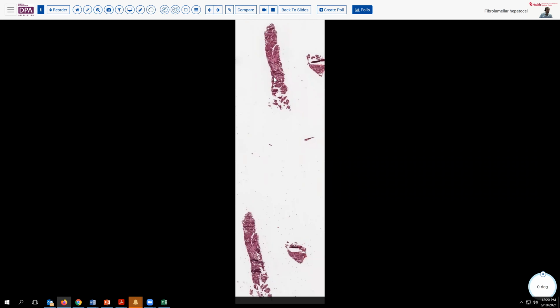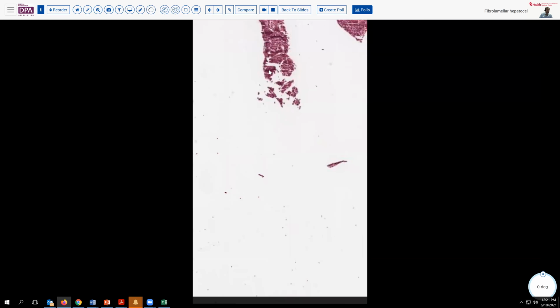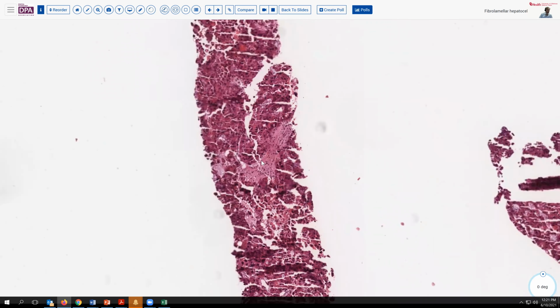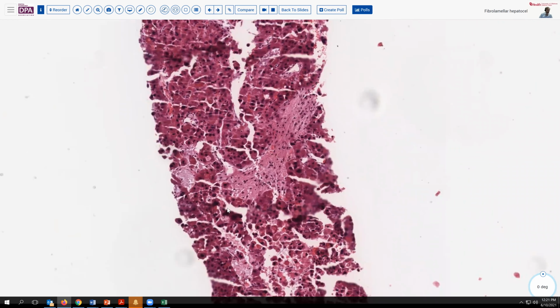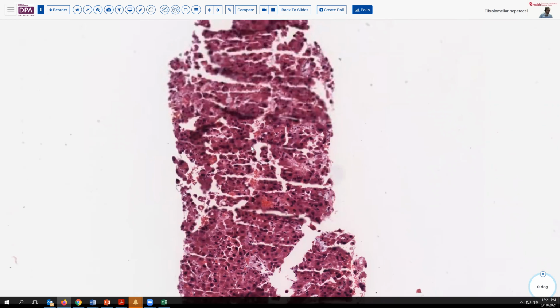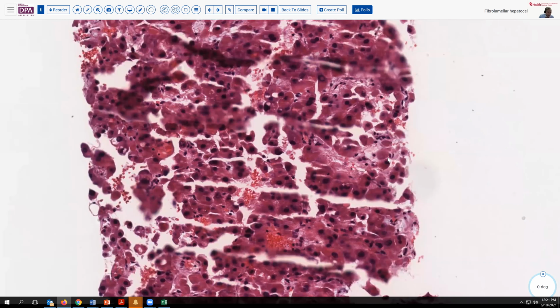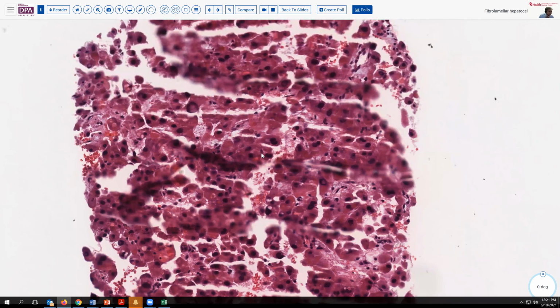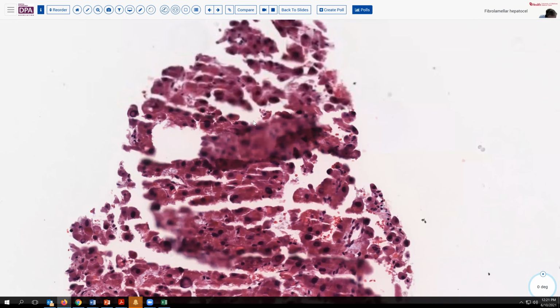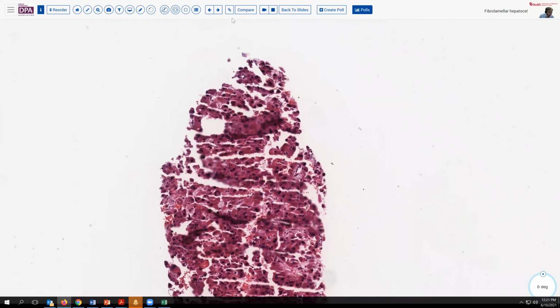So let's take a look. Here's a needle biopsy, and let's see what we've got here that might classify in this category. So we have some fibrous bands here. And of course, this is a rather wrinkly needle biopsy, but I think we can say that these are fairly large cells and maybe a little bit oncocytic. It's kind of darkly stained. It's not highly pleomorphic, but it's certainly atypical. And so this might come into the consideration.